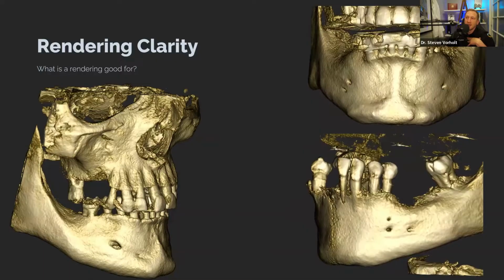So here we see the rare double foramen on the upper right and the even more rare triple foramen. And when you do run into these cases, you do have to treat every foramen with respect, because there is some innervation that leads to the lip coming out of each of those. And so we can't just cut the tiny ones and stick around with the big ones. But it's nice to be able to see that in some rendering clarity.